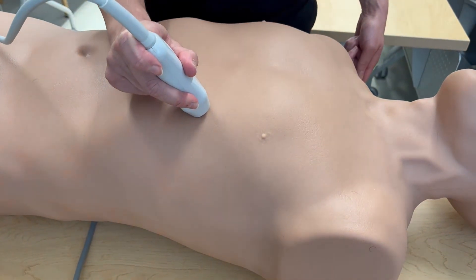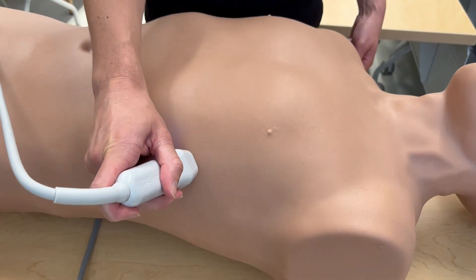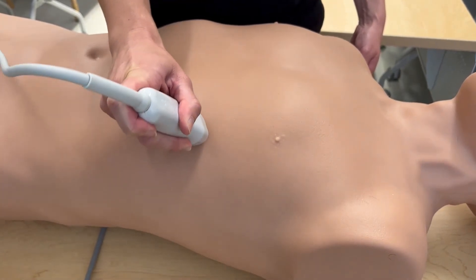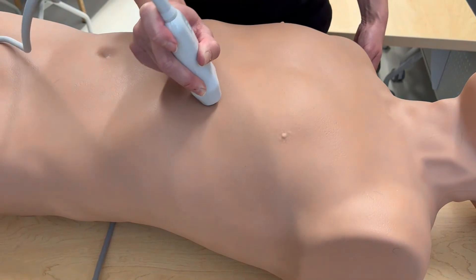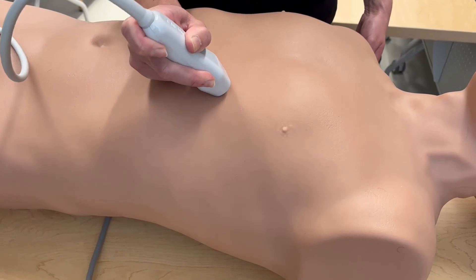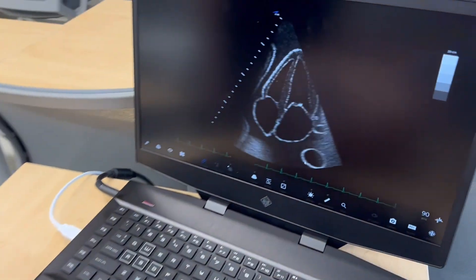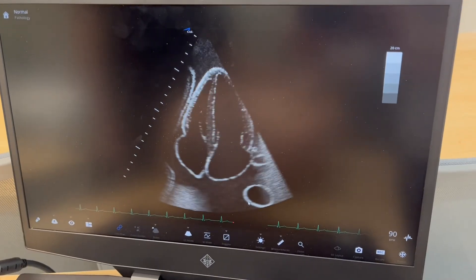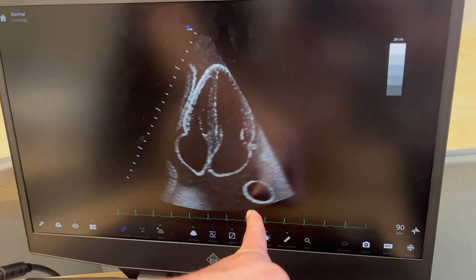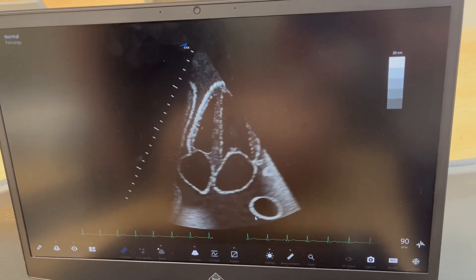If scanning on a patient who has cardiomegaly, you may need to move the probe quite far over, almost all the way to the anterior axillary line. Versus on a patient with a normal size heart, the view will be more on the anterior aspect of the chest. The view we're looking to obtain shows all four chambers of the heart, with the right side over here and the left side over here, as well as a clear view of both valves and both ventricular walls.